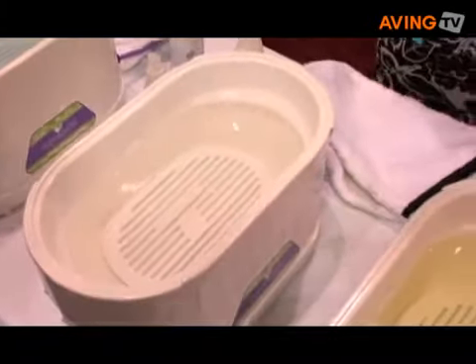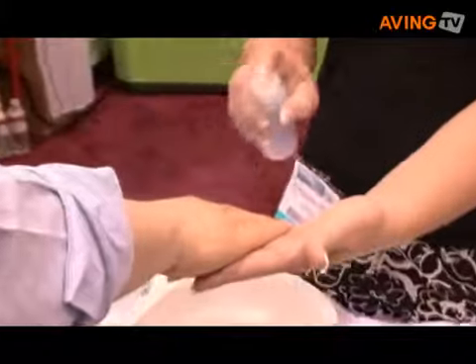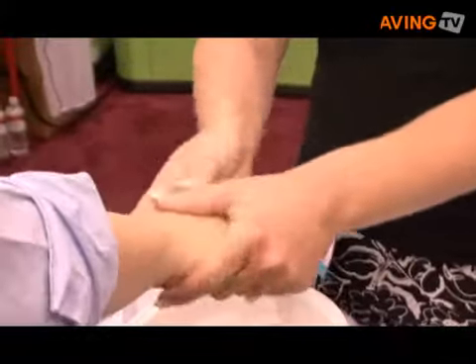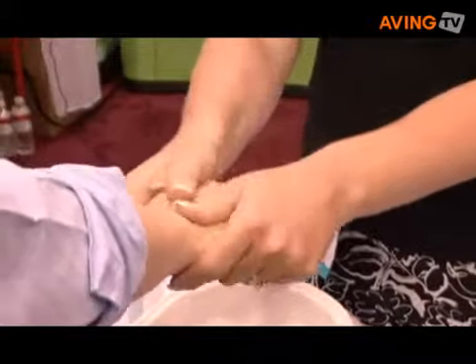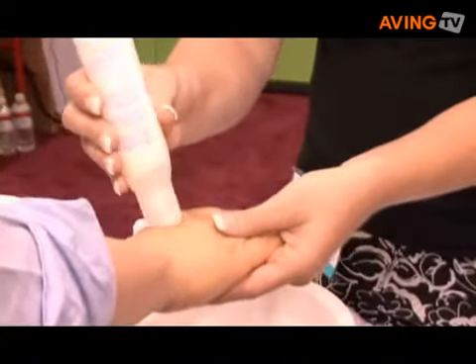Can you show us how that works? Absolutely. Paraffin therapy was originally designed for arthritis pain relief, so any pain or stiffness that you might have in the hand, it'll help alleviate that. Paraffin baths are considered medical devices — we actually can claim that they help relieve arthritis pain. A nice side effect is you get great moisturizing skin.